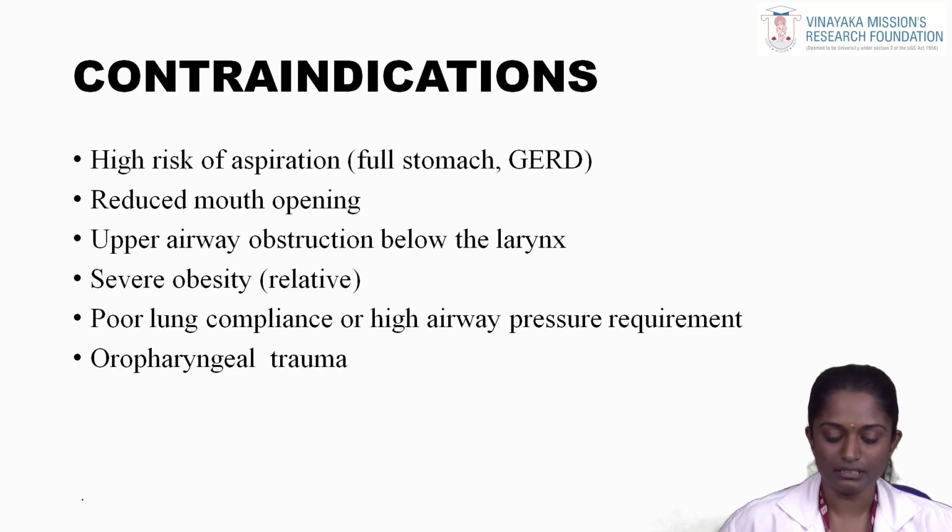Contraindications, where we must not use this: high risk of aspiration, that is full stomach and GERD patients, reduced mouth opening, upper airway obstruction below the larynx, severe obesity, poor lung compliance or high airway pressure requirement, then oropharyngeal trauma.